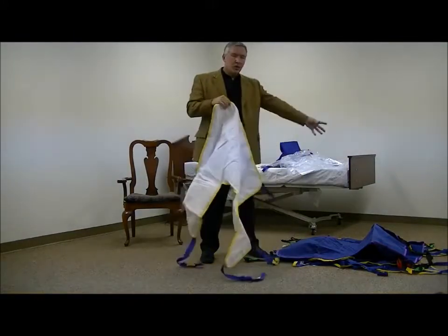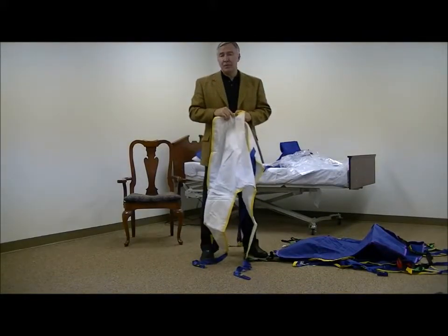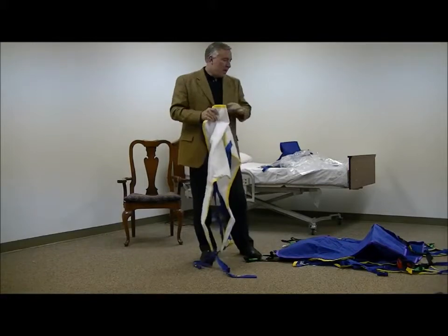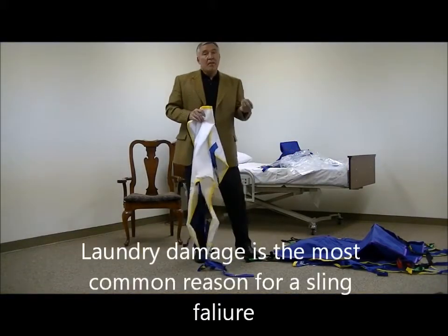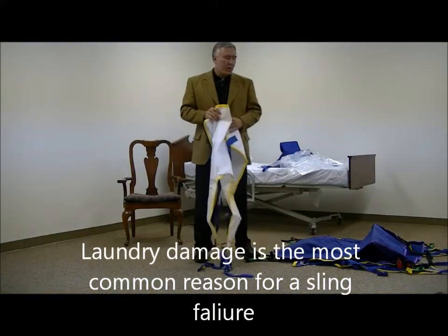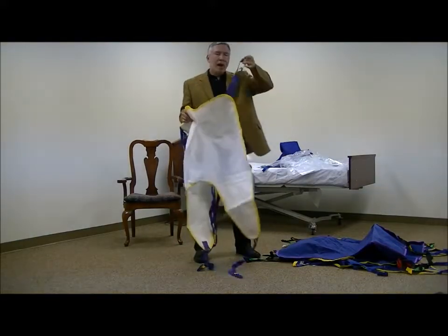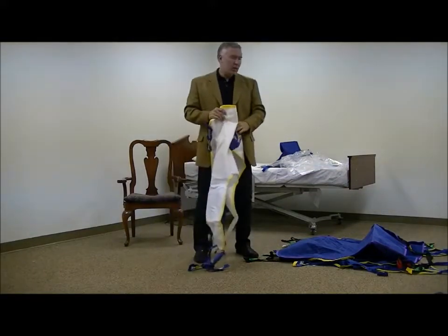The slings I showed you earlier all have specific washing instructions that require you to wash them at a certain temperature, add no bleach, and not add certain additives to them. If you don't follow the instructions with slings, you can damage the binding and create a safety issue. There have been many cases where slings get damaged with bleach and the straps get weak — and that's the point supporting the patient, so it can be extremely dangerous.